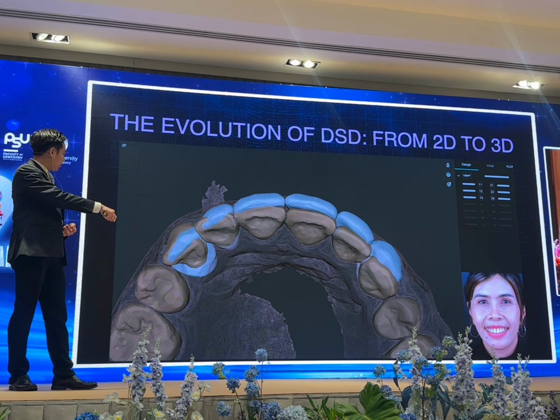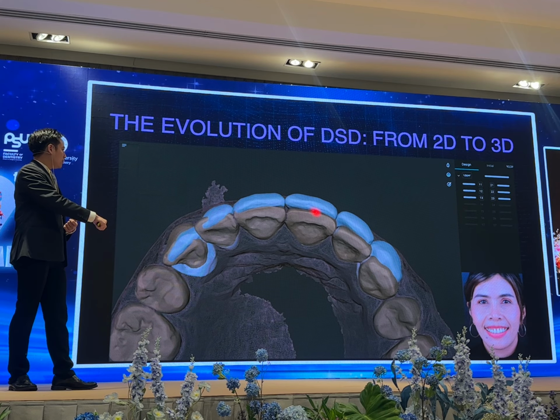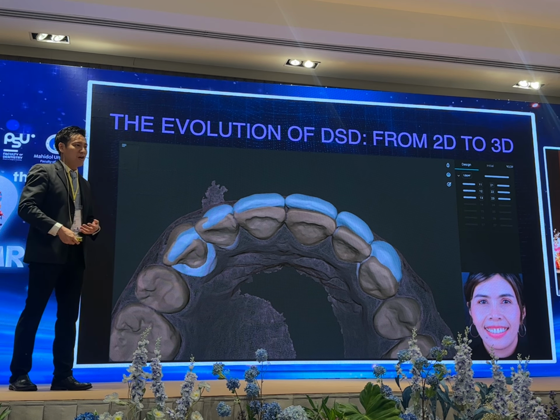Let me show you some here. This is what happens when you do only the 2D smile design, and you did not realize that, in fact, sometimes it's not possible.